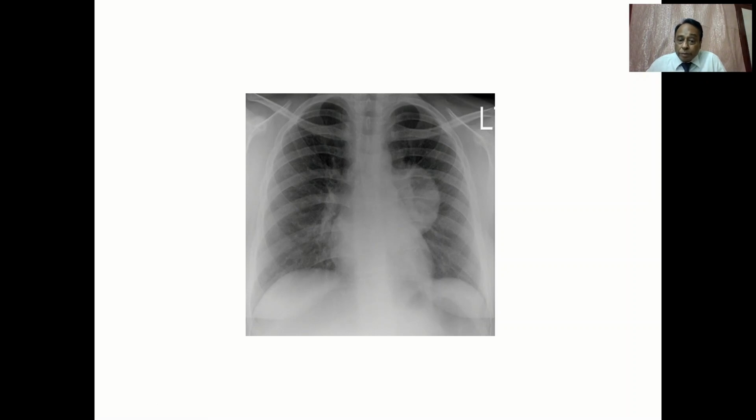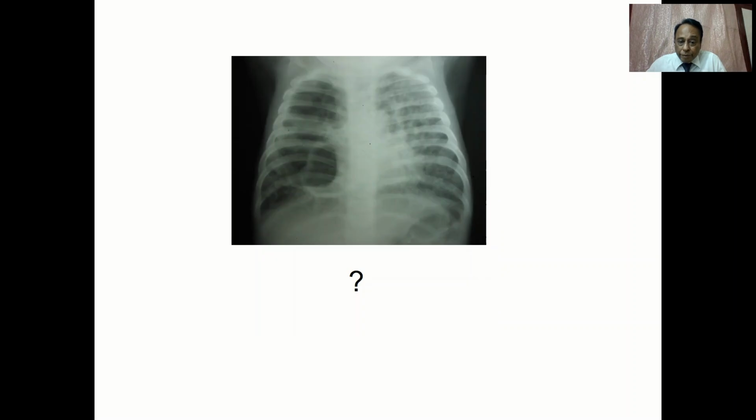So X-ray has a lot of limitations. In that case, you have to go for other higher modalities like CT. Contrast CT is very, very important.